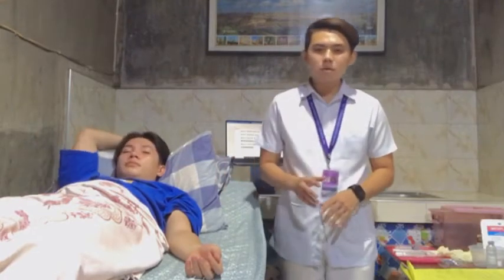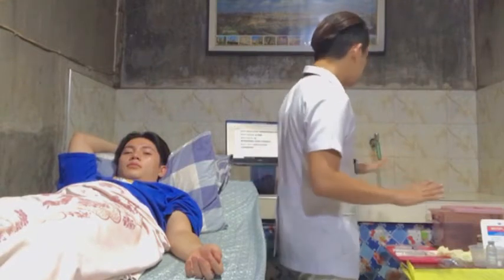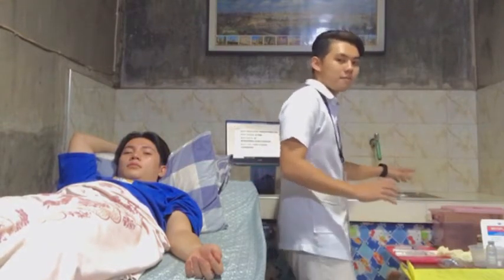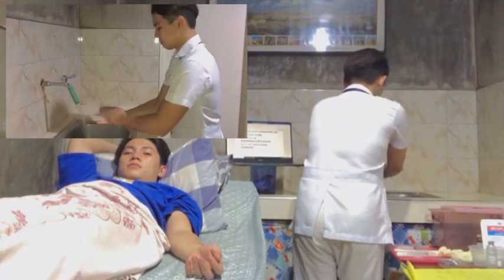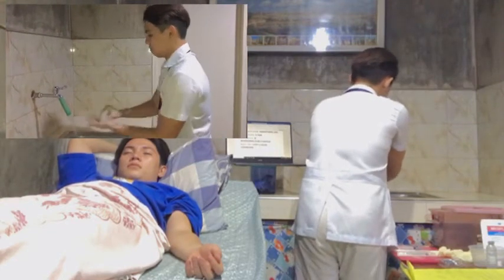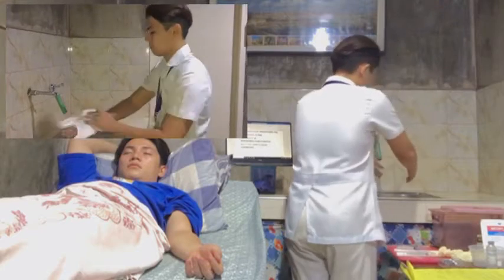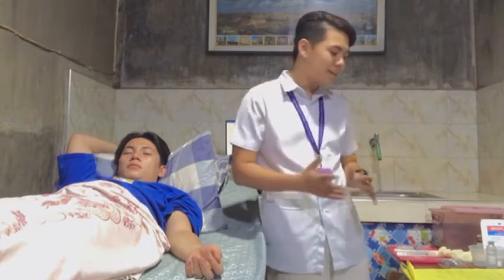Okay. So next, we will perform hand hygiene and observe appropriate infection control procedures to deter the spread of microorganisms. Okay, so after that, we will be arranging the medication card on the hypodermic tray with the corresponding drug, because organization and planning result in economy of time and effort, and it will minimize confusion.